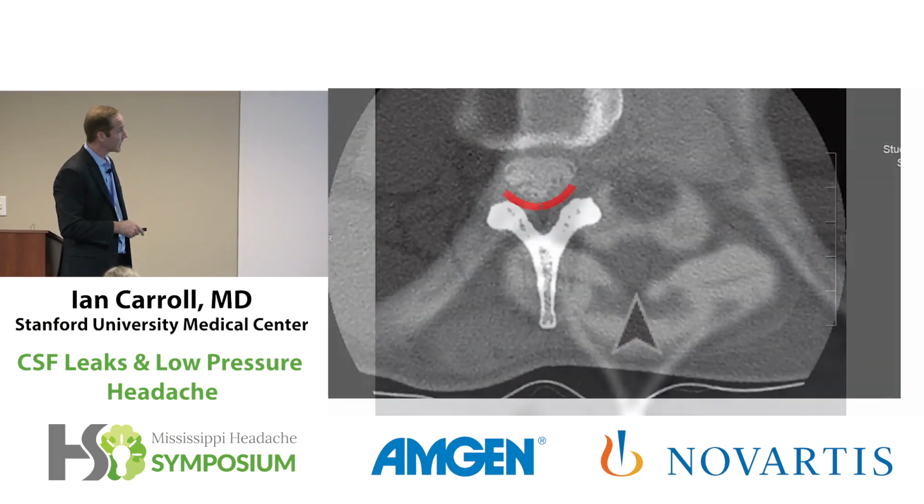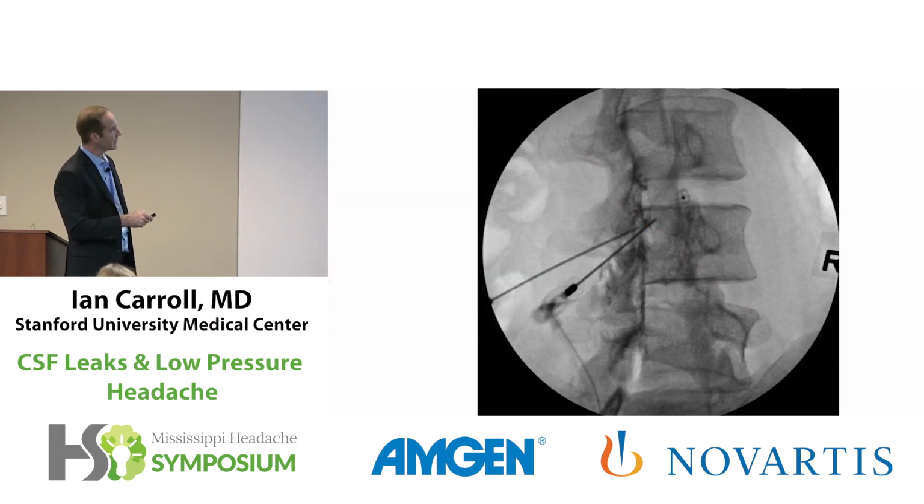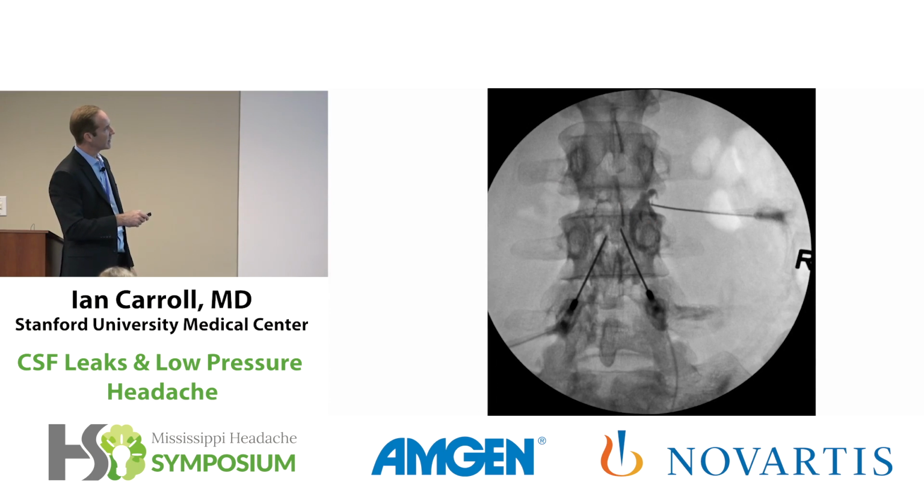Now you've got a problem because your spread is here, but what you may need is spread there. And so if you want to get spread there, you've got to put in a needle like this, not just inject there. You got to get into that plane. So that's what we're doing here with this needle. We've now rotated obliquely to come in on that oblique angle I just showed you. You see it coming into the foramen here, and the spread even looks different in that ventral epidural space.